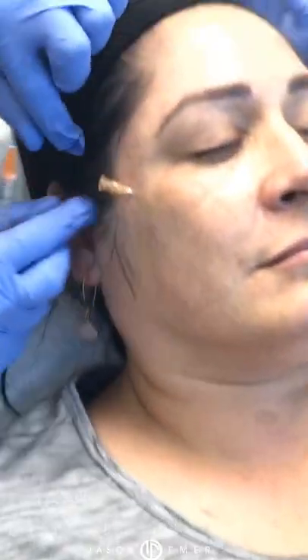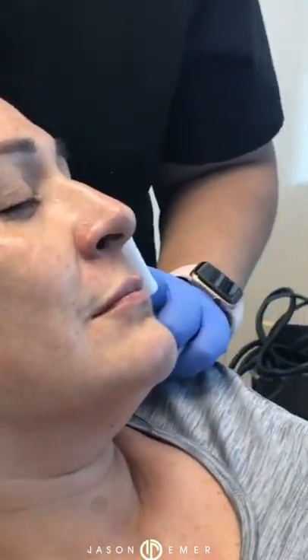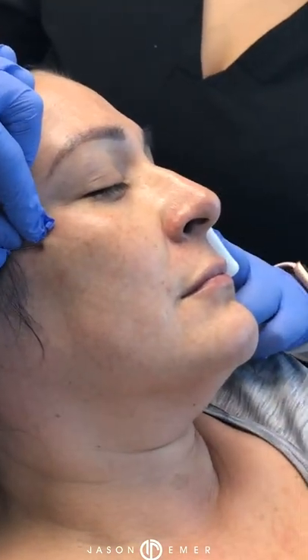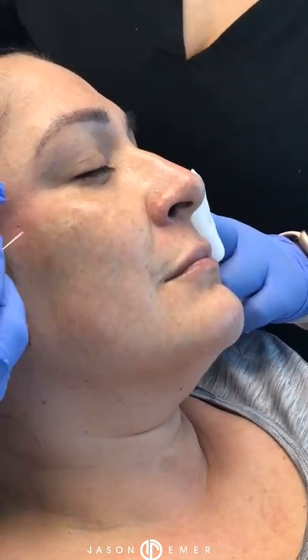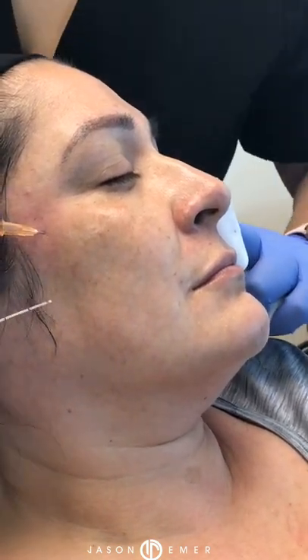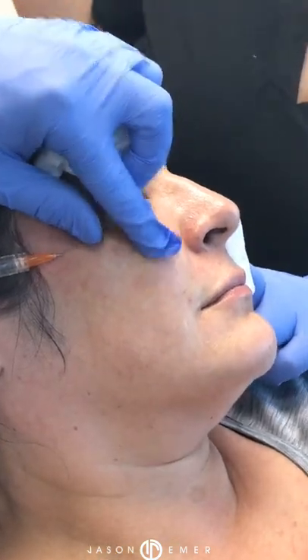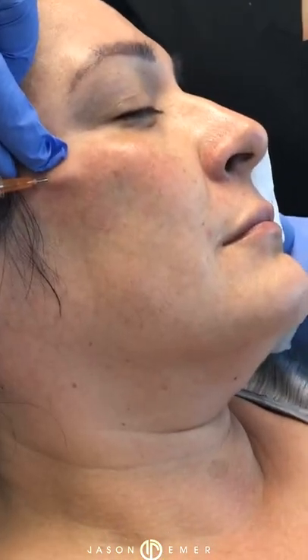Now, defining the lateral part of the cheekbone. Turn a little bit this way. Giving a little lift to the midface. Go ahead. And using a reversible product called Restylane Define if we really needed to reverse it. Most people never need to. Sorry, okay. One more poke. Sometimes the cannula, since it's blunt ended, put it on, straighten it out, go ahead. There we go. Again, right through the tissue to that deep fat pad. Good. Again, in that support area, line between corner of the mouth and lateral cheek.